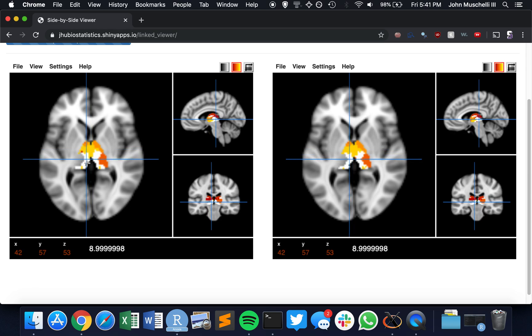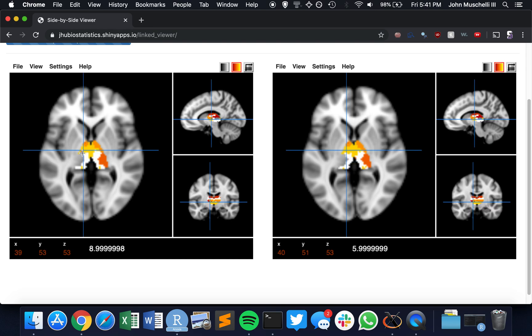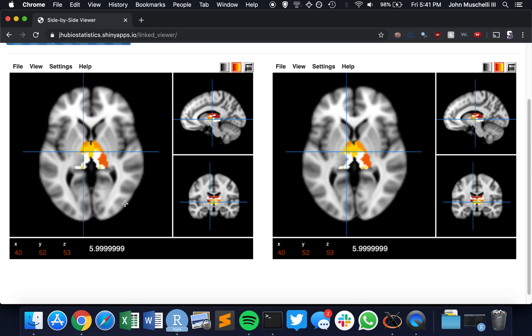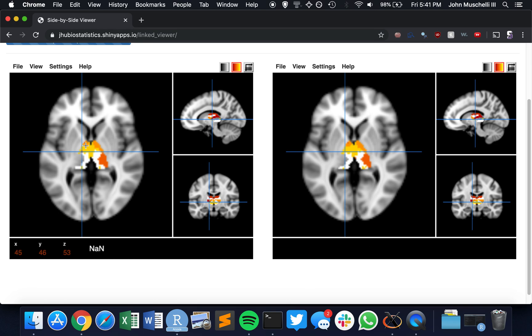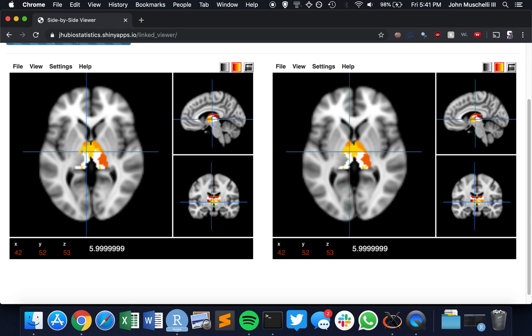But we do see some slight differences. So for example, let me see if I can go to this voxel. That voxel is labeled 2 in this parcellation, and it's labeled 5. So if you click and hold, you'll actually see it in both of them.